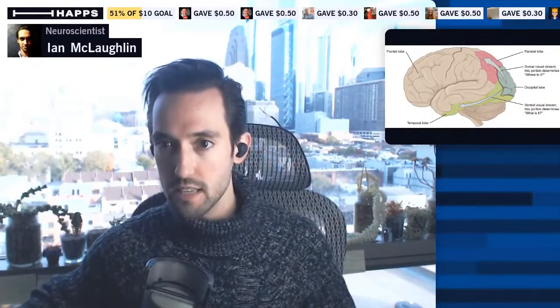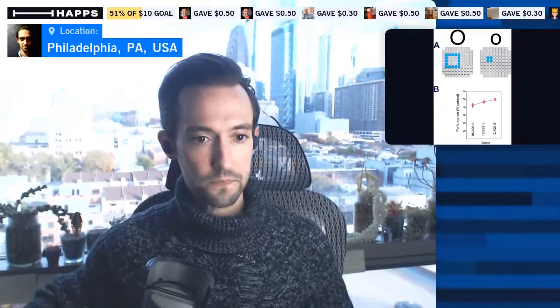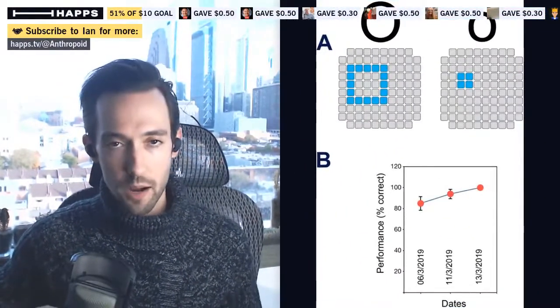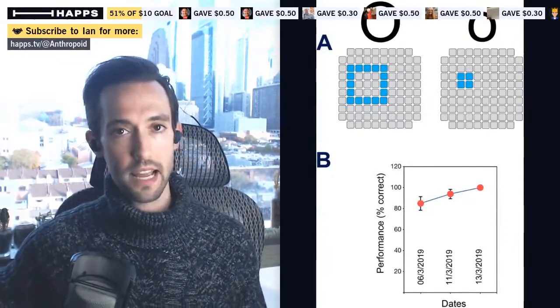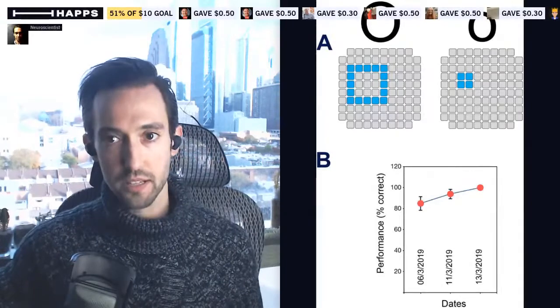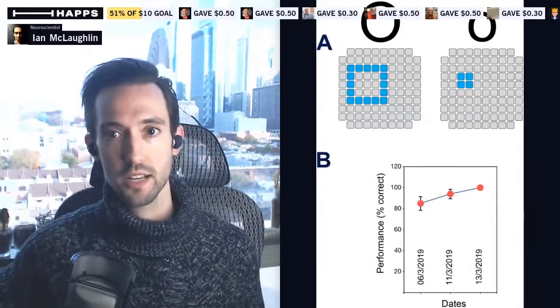And so you can see, no, not that one. That's how my daughter would say it. This one. So you can see here. I'll make it a little bit bigger so you can actually really see it. And so on top of this figure, you're literally seeing which of the electrodes were sending activation, right? We're stimulating the neurons close to them, near the electrode in Bernadetta's visual cortex.